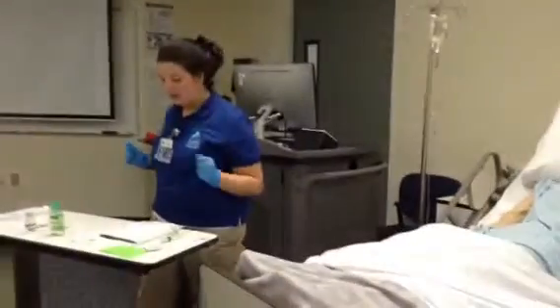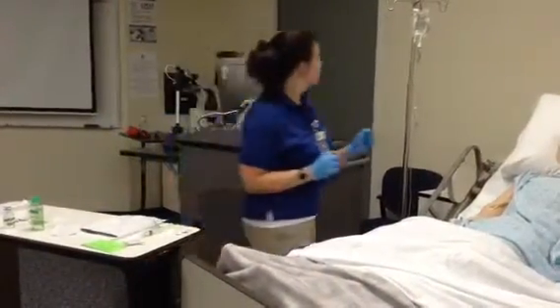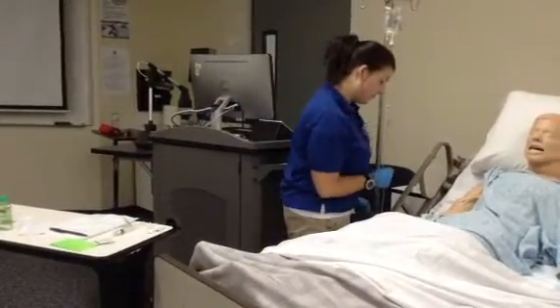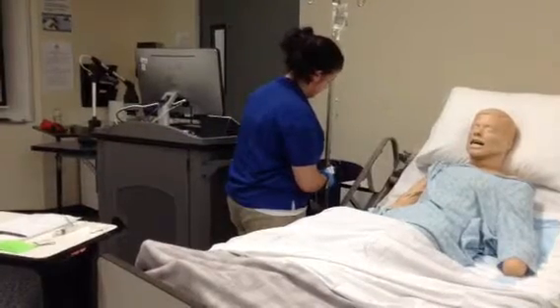Okay, now that these are good, alright, and let me go ahead and observe the site. Once again, no infiltration or phlebitis present.